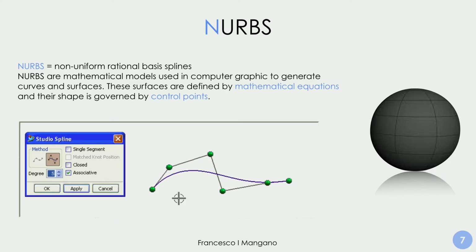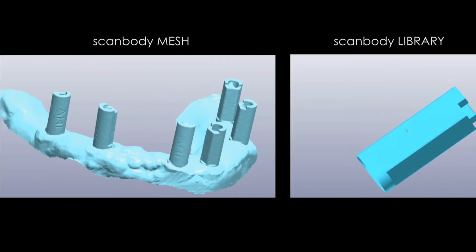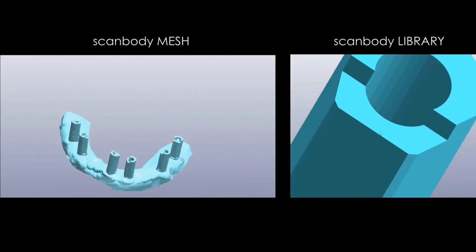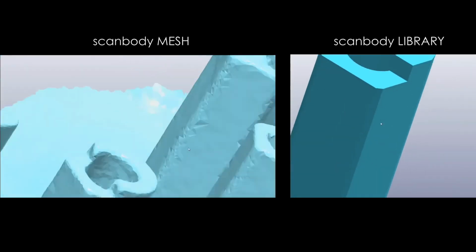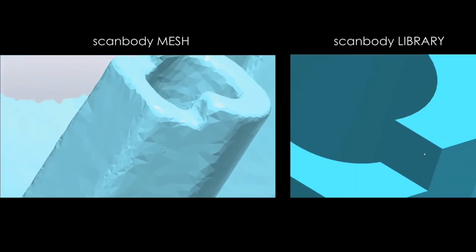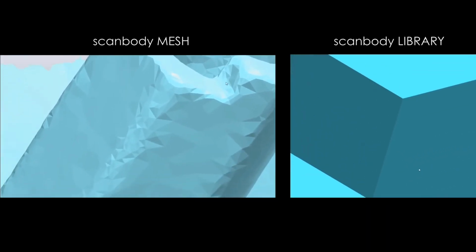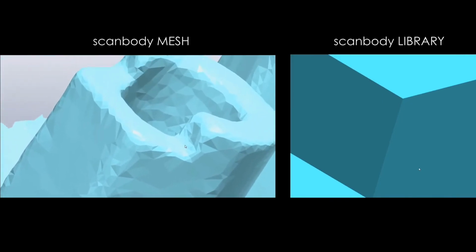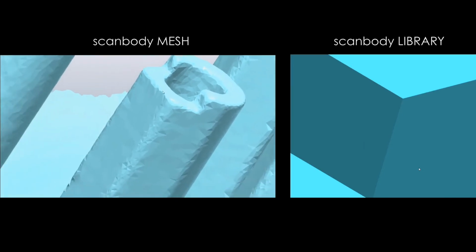The format is the same, maybe it's saved in STL, as stereolithography or standard tessellation language, but the appearance is totally different. In this video you see that if you take a look at these files, they look similar, but if you go closer, if you look with attention, then you see that the mesh is a geometric approximation, because there are a lot of triangles and you cannot see the edges perfectly, for example, with the angles, and it's a triangulated surface, so everything is smooth.